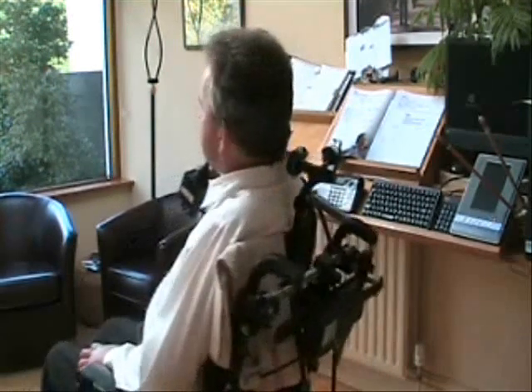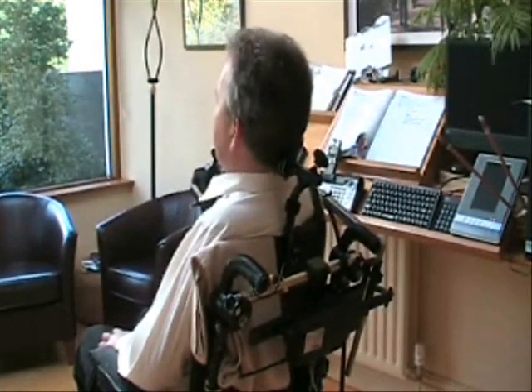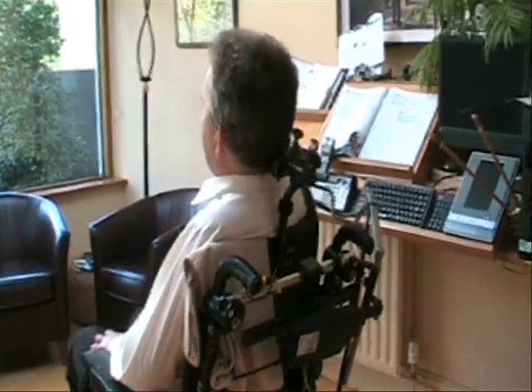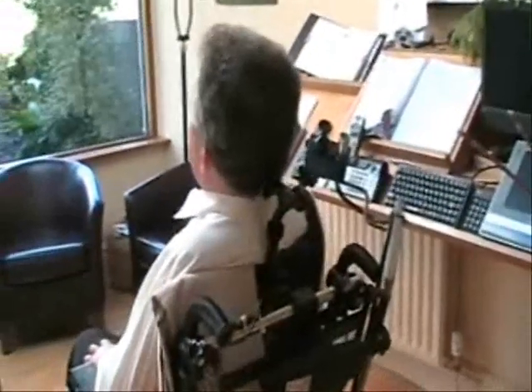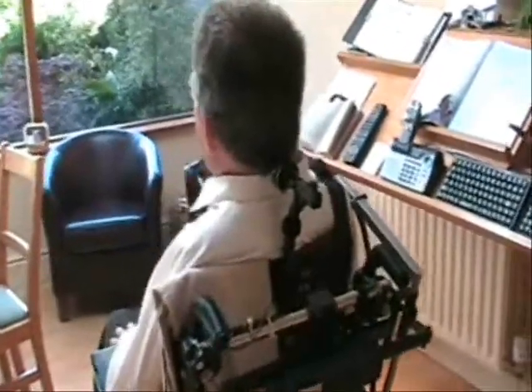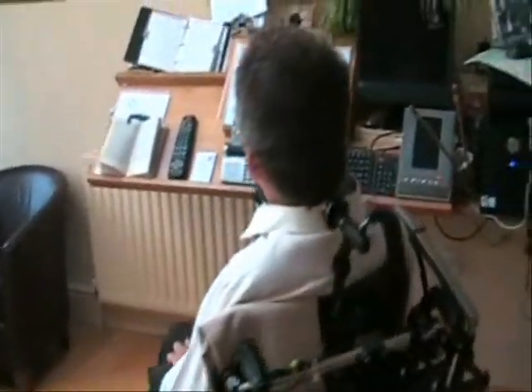Because I needed the switch to be neat, I needed it to be out of the way. So that was when we came up with the switch at the back, which I just lean back, touch it, and then lean back again. And then the switch operates the arm.